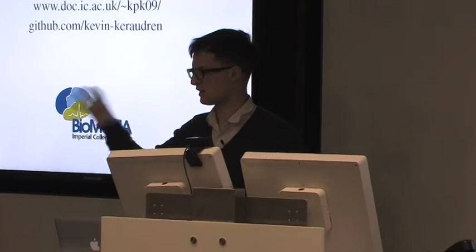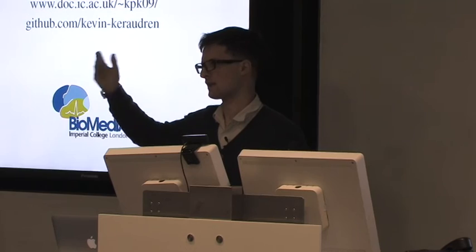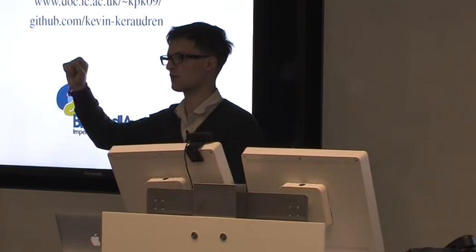What the clinician wants to look at is, currently most of them look at the slice by slice data, but they would also like to be able to look at it as a 3D volume. Reslice it in any direction, rotate it in 3D, and for this they need to do this motion correction. And for this motion correction, currently they need to do some manual segmentation. So that's where I come in and I say, hey, we could do this manual segmentation automatically.